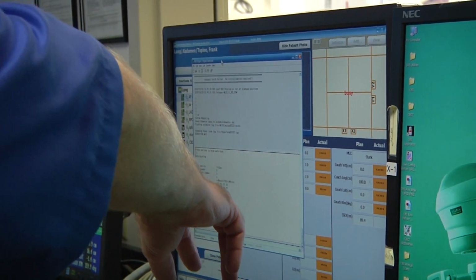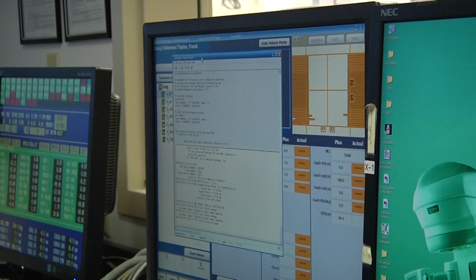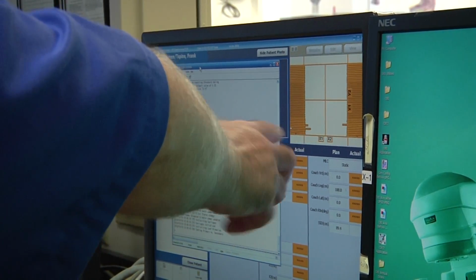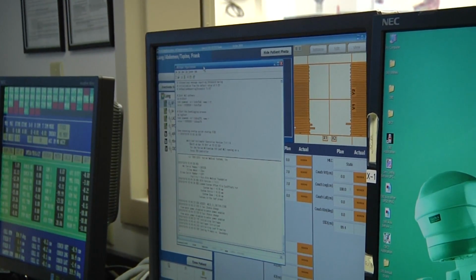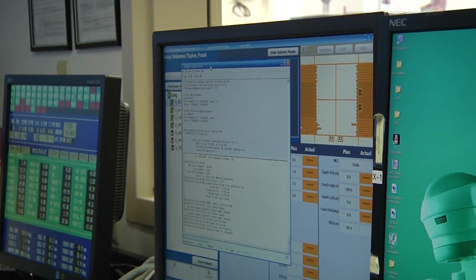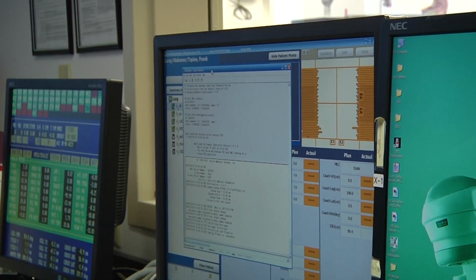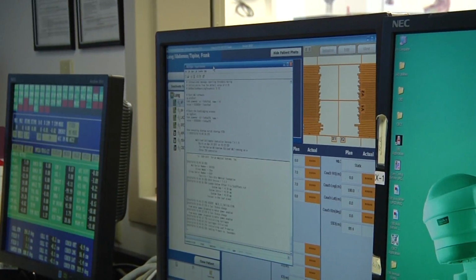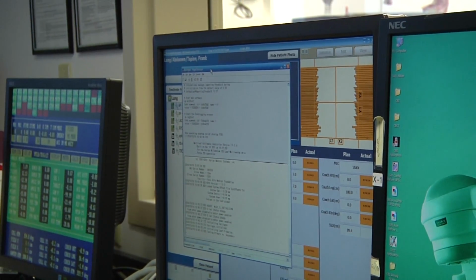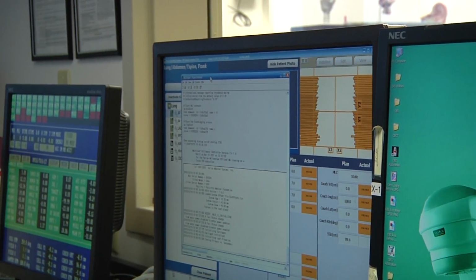And once the system establishes communication, you'll see your leaves up here. Okay, so now you're actually seeing what's happening during the communication. So what it just did is it moved the leaves, or the carriages, off these little switches that are inside the unit. Moves them off and comes back. That tells the system where the carriage is at. Now it's just moving the leaves to make sure I'm telling all the leaves to move forward, and the computer saying, yes, all the leaves are moving forward.